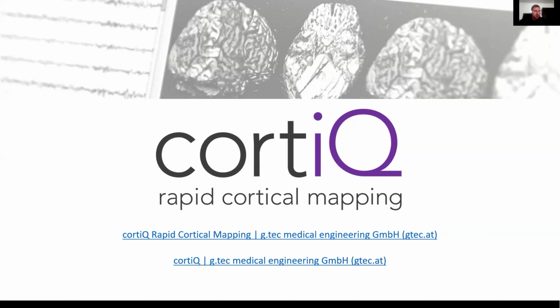So for example, under general anesthesia, you can already measure motor fibers by motor evoked potentials and SEPs, but with language that is still only possible with the awake surgery. And here the high gamma mapping and the ECS and the CCEPs are a very powerful tool.